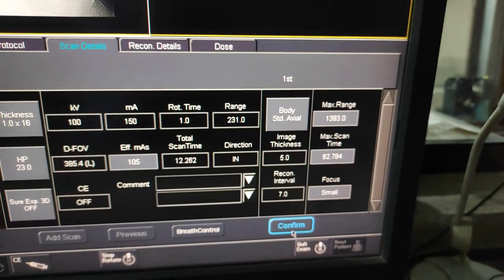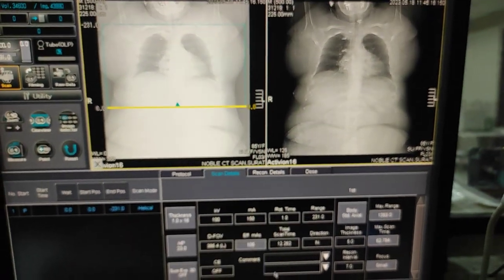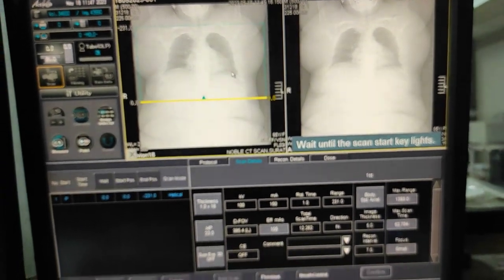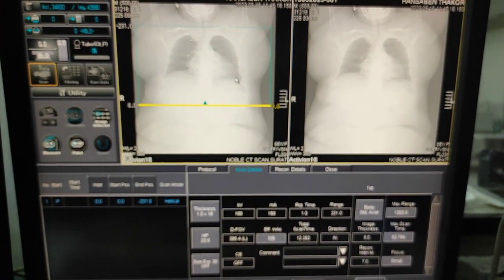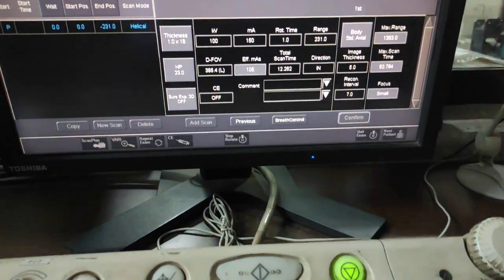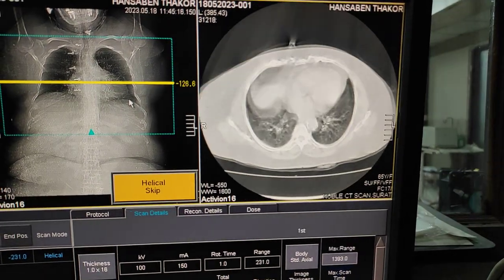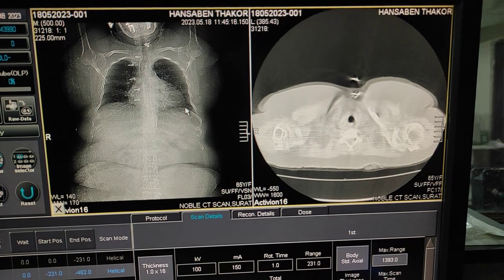Confirm the thickness is one millimeter. Ask the patient to hold their breath properly, otherwise there will be lots of artifacts in the HRCT scan. Again click two times and ask the patient to hold the breath. Now everything is ready — click the scan button. The scan is over.